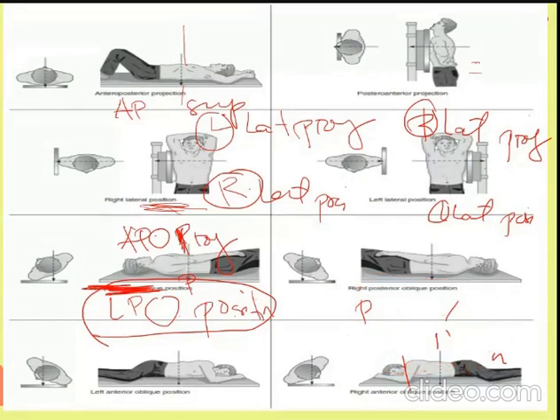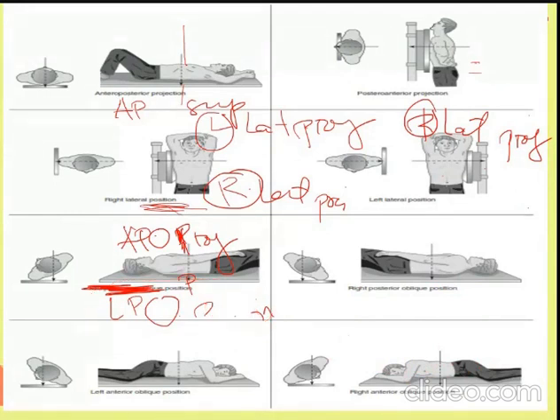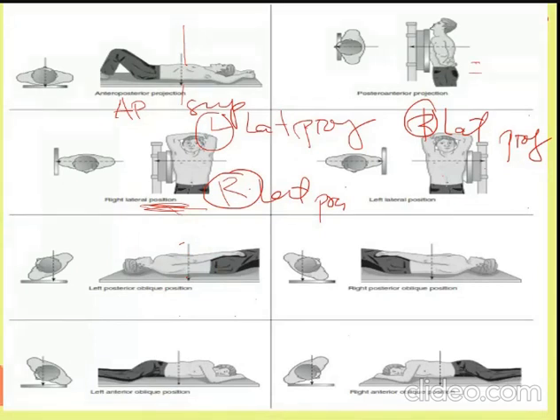Sige. So how about this one? What position is this? Right posterior oblique position. How about the projection?